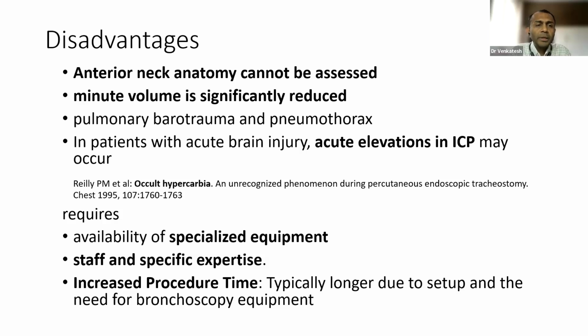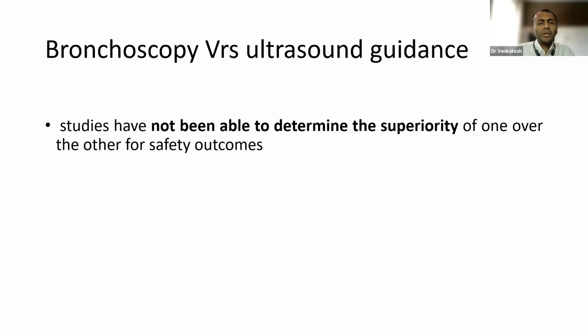It also requires availability of good equipment, bronchoscopy, and staff to help you at the head end. You need some people who are experienced in handling it, and so you need more manpower. It may also increase the procedure time because you may have to set up, introduce the bronchoscope, and stabilize. So it may be slightly more time consuming, but studies have shown that it is not very significant, just slightly more time. But which one is better, bronchoscopy versus ultrasound guidance?